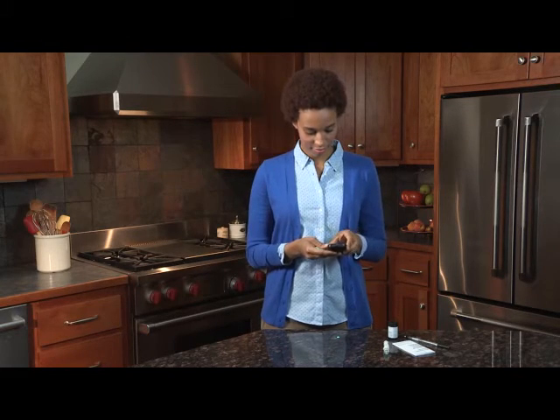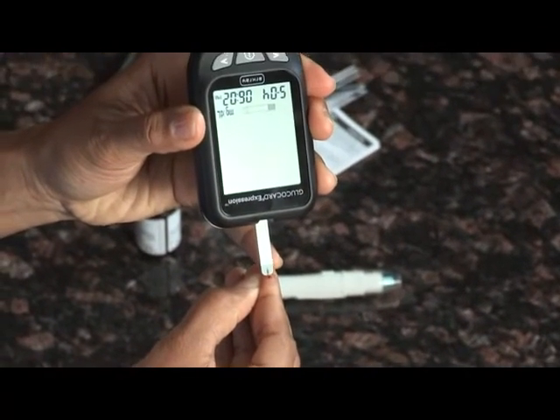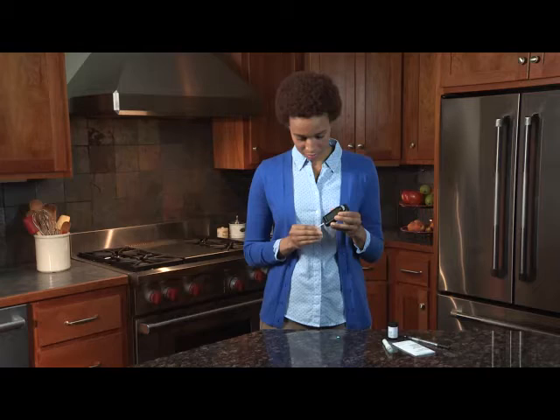Next, obtain a blood sample. Gently bring the test strip to the drop of blood at a slight angle. Keep the test strip in the blood drop until the meter beeps to indicate the test strip has enough blood.